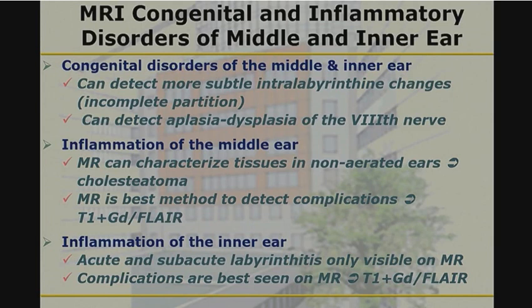I'll ask a question of Pat. I mean, usually the issue that I run into is fungal infection versus tumor, and some of your findings where you have bone destruction you can see with fungus. So any tips on making that distinction?